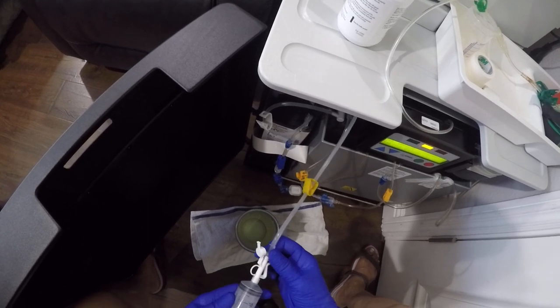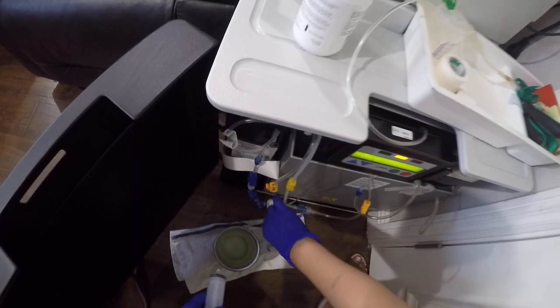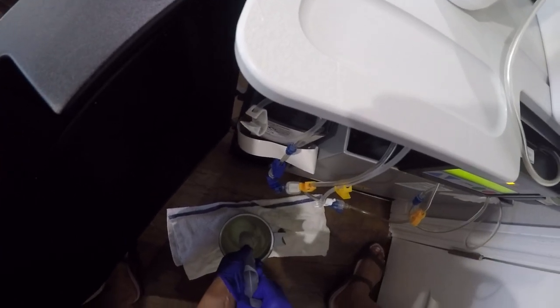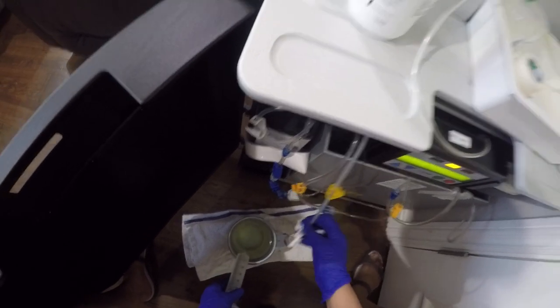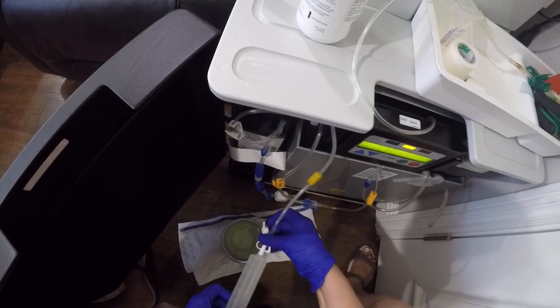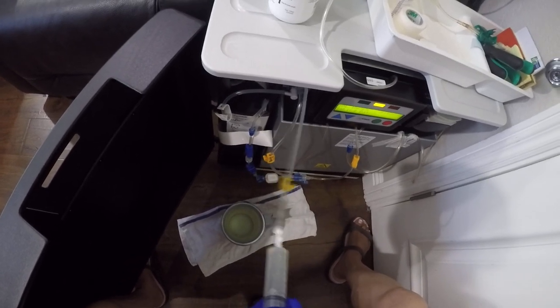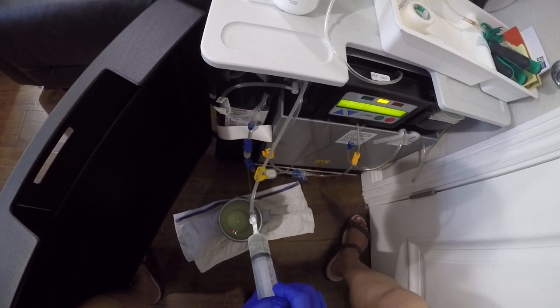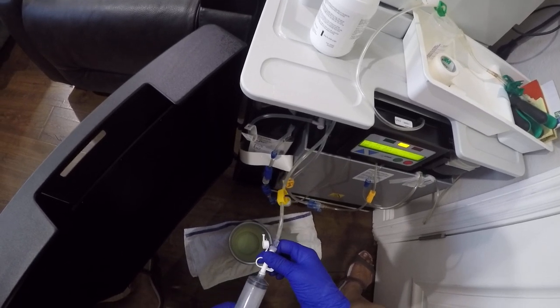Unscrew it, then fill up the drain line all the way to the top — top it off so that it doesn't spill and leak. Then attach it to Mr. Peanut and flush it.